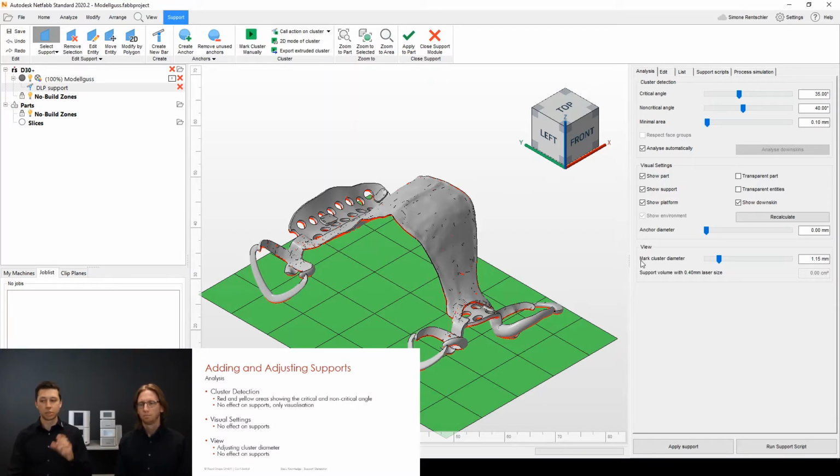So, for example, the first step is the cluster detection. This one is just automatic cluster detection, and you will have to fill in the minimum or the non-critical and the critical angle for this part. In another webinar, we showed you roughly how these values can be set, but it's all depending on design, material, and thickness, for example. So it's all based a little bit on your experience.